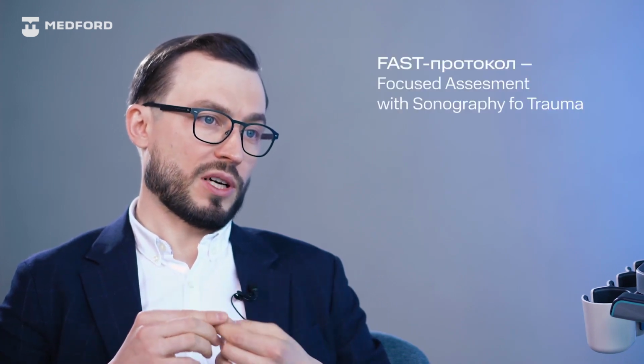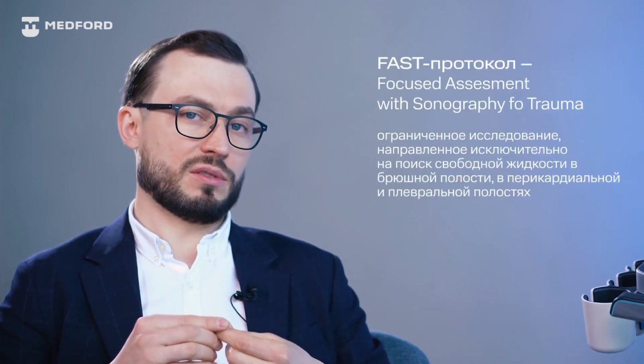Yes, and therefore here we can talk about two, probably four directions that are suitable for intensive care and anesthesiology. This is primarily a protocol aimed at evaluating patients with polytrauma.